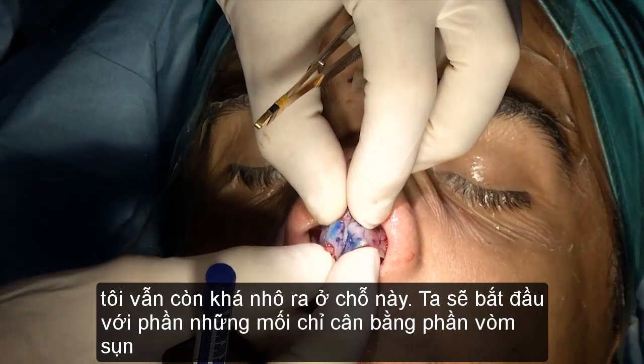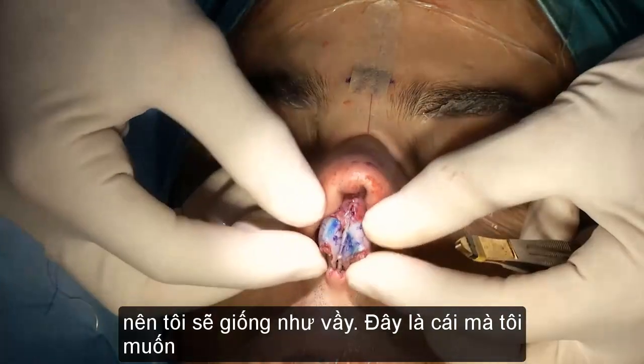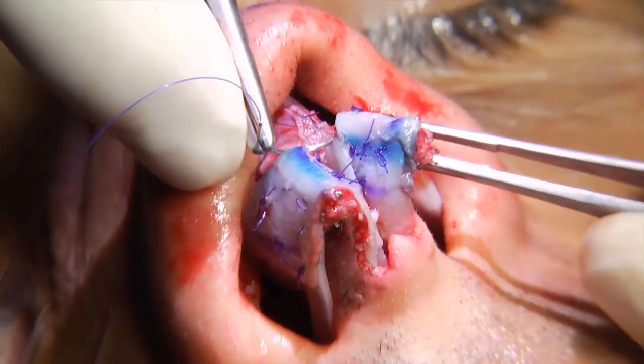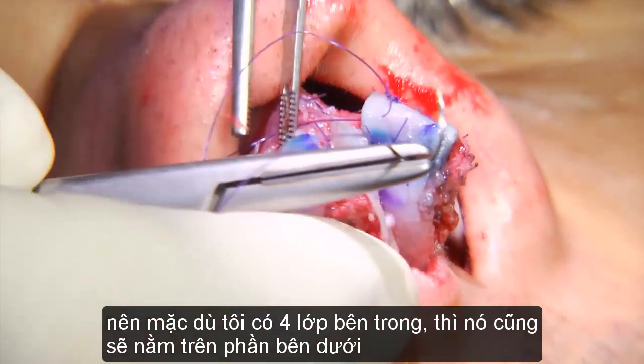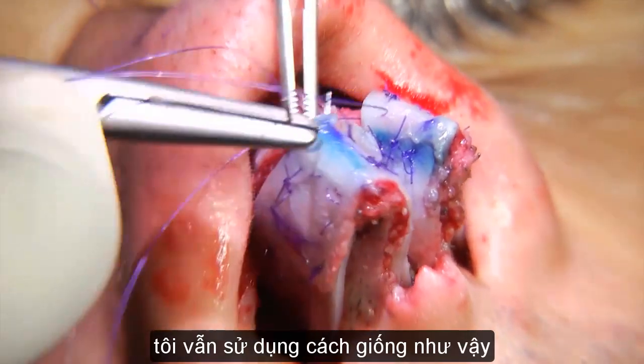So let's start with the dome equalization sutures. So in like this, this is what I want. So although I have 4 layers since I did the underlay, I still will use the same concept.